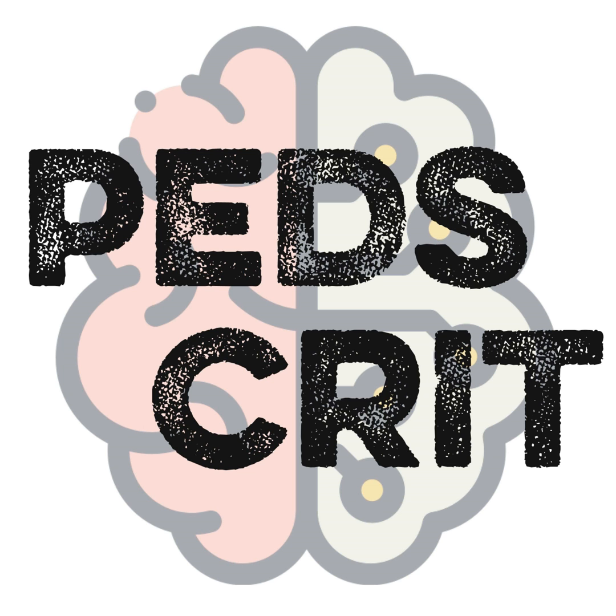So as I mentioned in the previous part, you don't have a lot of things to set, but the PEEP, the NAVA level, and the FiO2, and also the backup ventilation and the alarms. For the PEEP, to be honest, this patient is probably already on a PEEP of 8 or 7 or 10 sometimes. Usually when we start NAVA, either we keep the same PEEP or we decrease it slightly because we add an inspiratory support. Usually we'll start with a PEEP of 7. And then comes the question of the NAVA level.